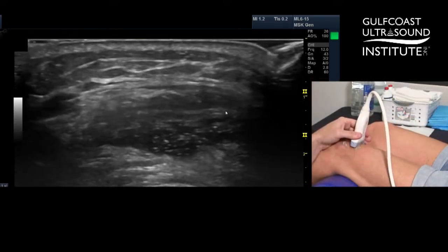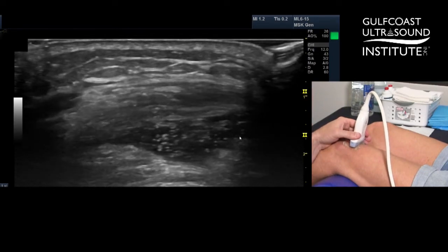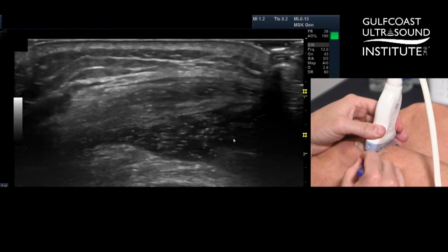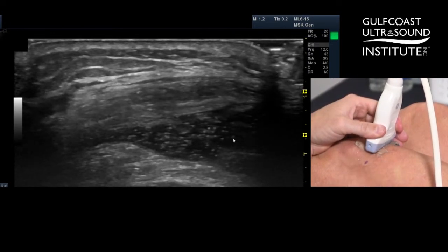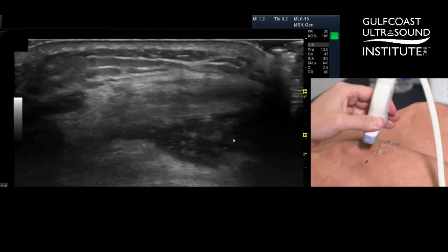In this case we are about a little less than two centimeters down, so I'm going to start my injection site about one and a half to two centimeters down. We'll mark this up and do a basically horizontal approach. This is a lateral suprapatellar aspiration/injection. We're not going to be anywhere near our injection site with our probe.